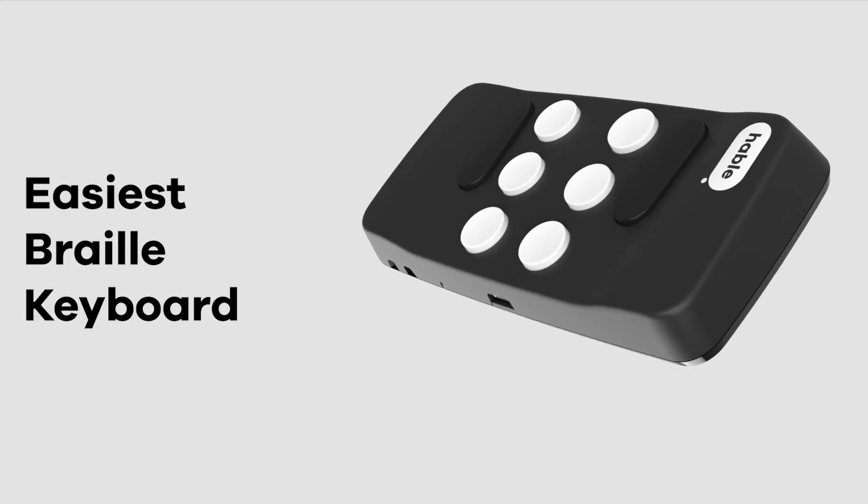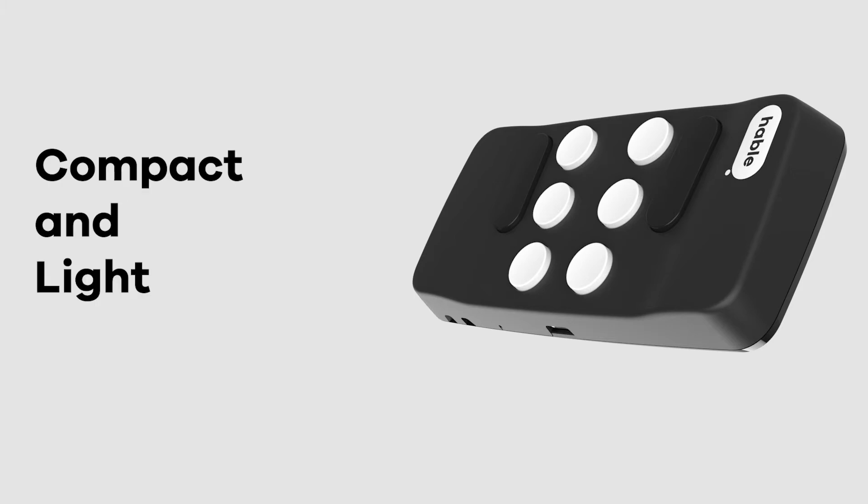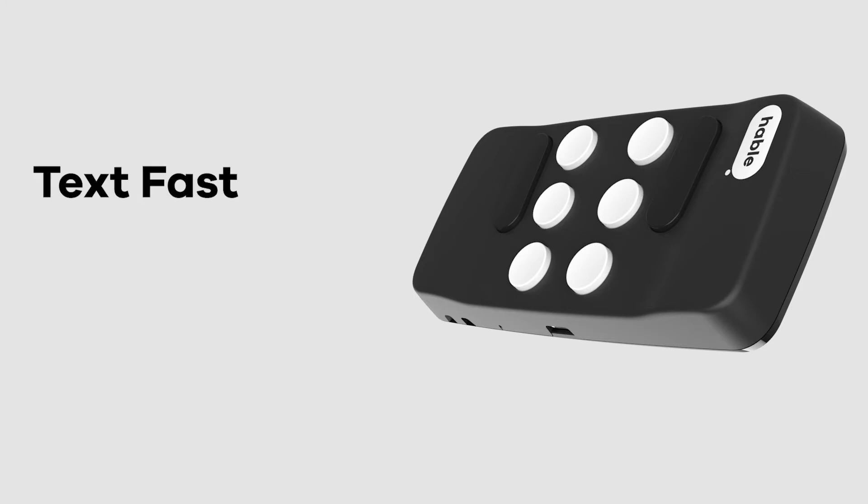What is the Hable One? The Hable One is the easiest Braille keyboard for your smartphone. Lighter than an egg, it fits right in your pocket. Typing with the Hable One makes your texting faster and more accurate.